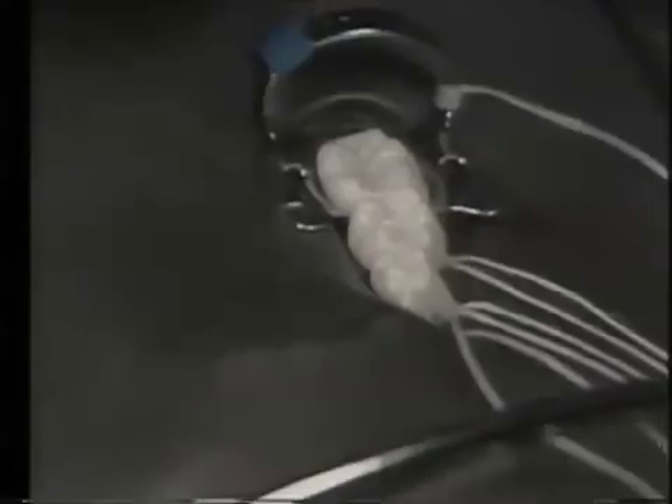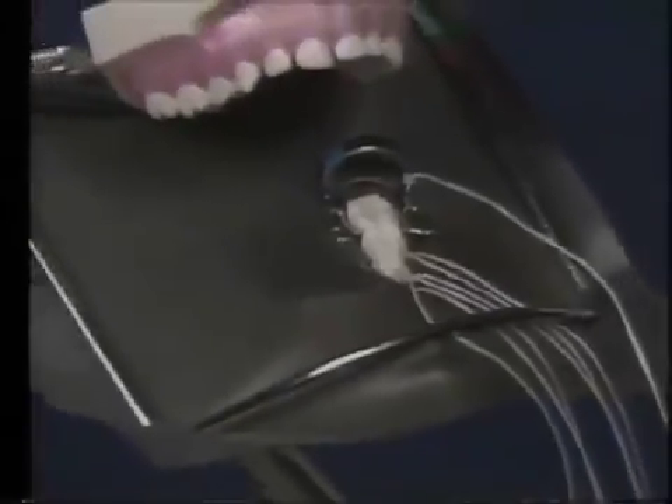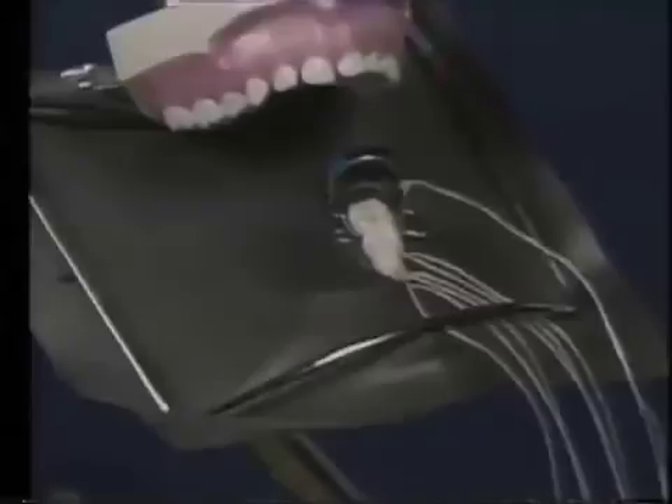This program is designed to show you two methods for placing the rubber dam on teeth in children's mouths. These methods are different from the method you have already learned. We will consider five parts in the rubber dam procedure.